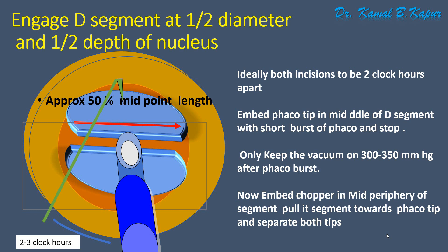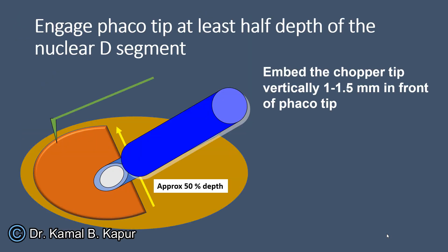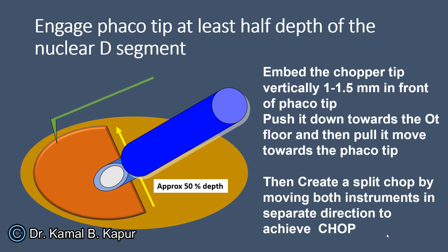Your chopper can sometimes cut the capsulorhexis, so negotiate the phaco chopper under the capsulorhexis, embed, pull it towards the phaco tip, and while pulling, separate it. In the lateral view, the phaco chopper is embedded at the mid-periphery, pulled towards the phaco tip with vacuum mode on, and separated. This creates two more quadrants from the D segment, giving you four quadrants total, which can be emulsified one by one.